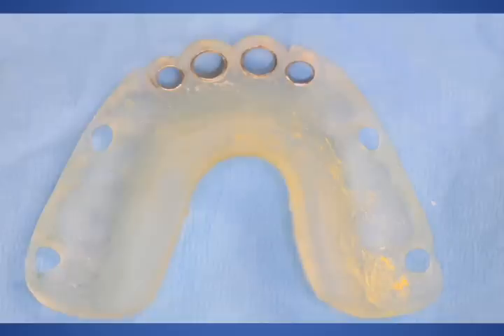We fabricate a surgical guide based on the CT diagnostics of the Nobel Guide scanning software. The laboratory is able to stabilize the 4 rings, which are surgical guide rings, quite nicely. But you can see there's no set pins to hold this appliance in place. It's more like a precision occlusal guard that will allow us stability and allow us to use the rings in the surgical placement of our dental implants.